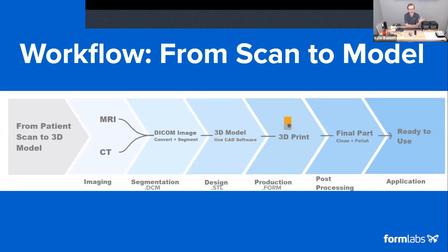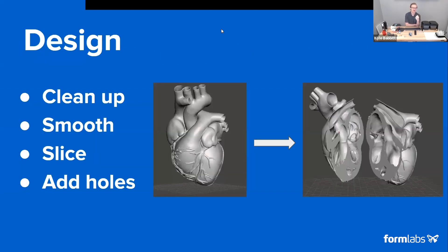Segmentation is used to group a bone, an organ, a vessel, or whatever region of interest you are trying to produce. The accuracy of that scan will translate into the dimensional accuracy and surface detail of the print. Later we'll be covering making drainage holes, slicing models, and smoothing models — basic design tips you can apply to the model from segmentation to increase printability. We'll also look at how I produced a model made out of two different materials in two different colors.